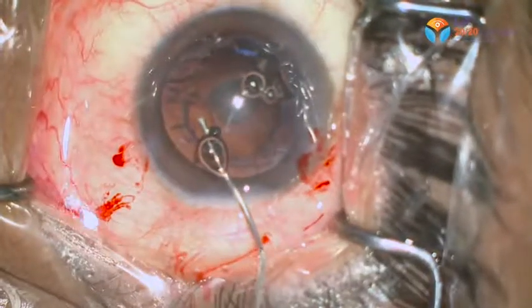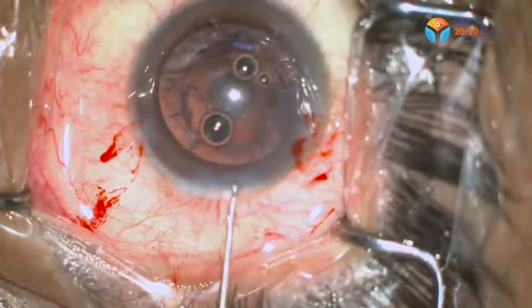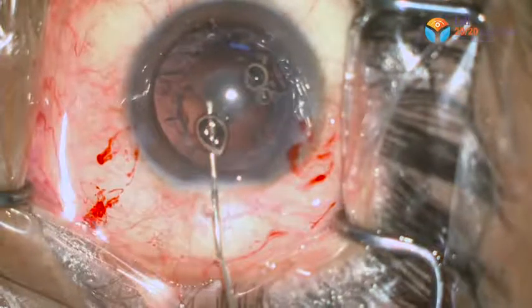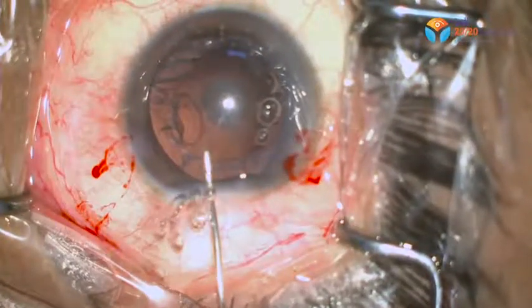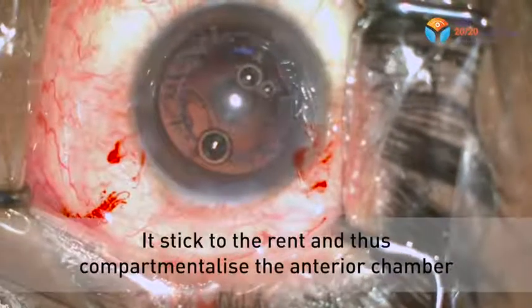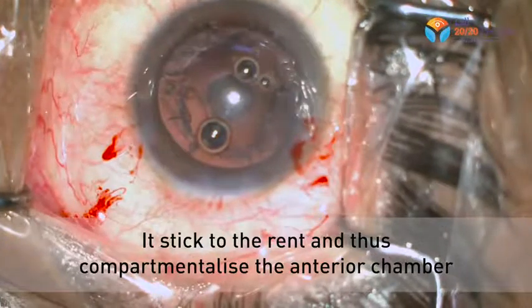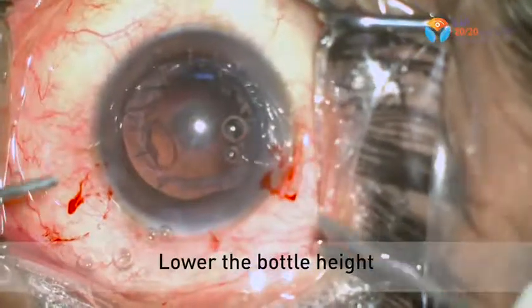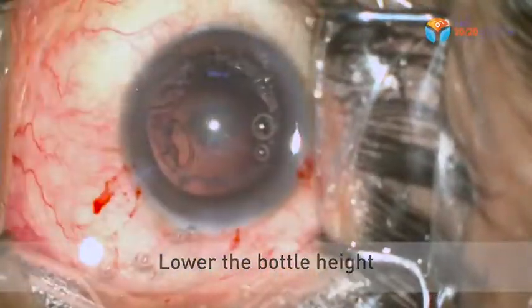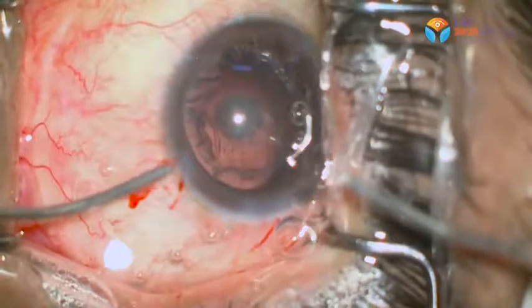As I was getting ready to manage this situation, there were a lot of options going on in my mind. First of all, I injected more visco-dispersive material into the anterior chamber. Now this material has a property to stick to the rent, thus partitioning the anterior chamber from the vitreous cavity. Then I lowered the bottle height and used the bimanual cannula. I made sure that the anterior chamber is well maintained throughout.